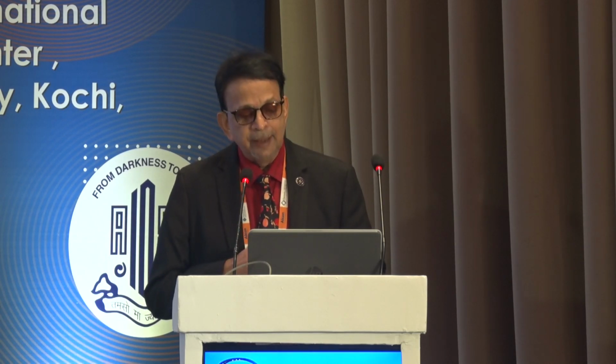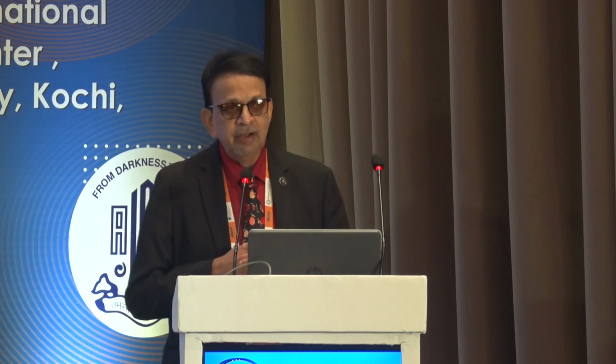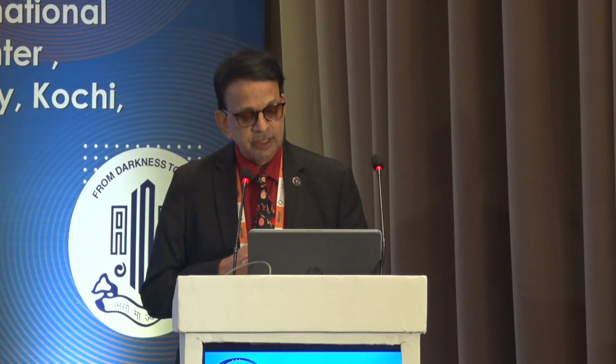You can see how many times I need to bury, and every time I bury, I need to give phaco energy. So this is to show you the difference. Of course, it is doable if you follow the parameters. Now and then you need to put viscoat into the anterior chamber, making sure that you separate that nucleus all the way.